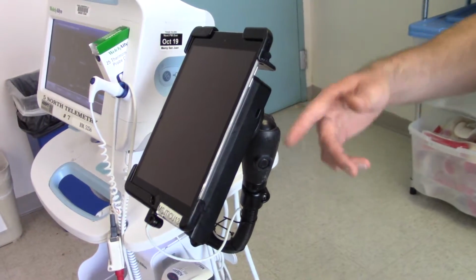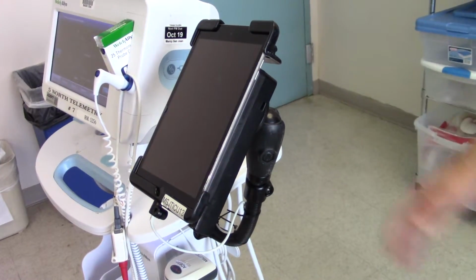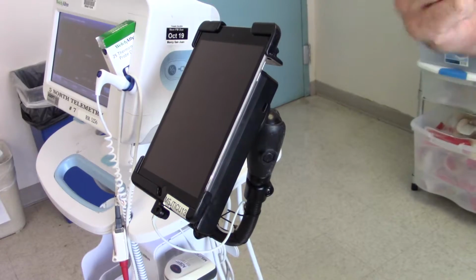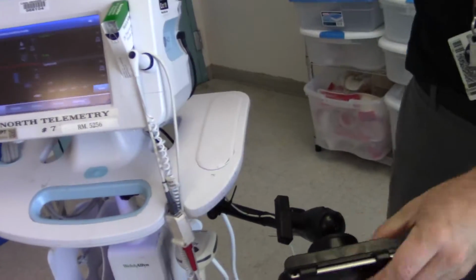I think anything that's metal, as long as it's not going to be prone to fall off and injure a patient. Yeah. Which is some of the concern I have here, with that thing whipping around, because they're right next to the bed. And if this arm flops down and knocks the guy, you know.